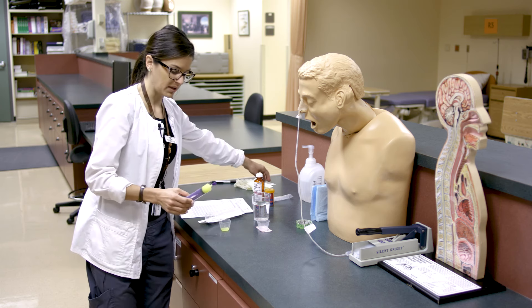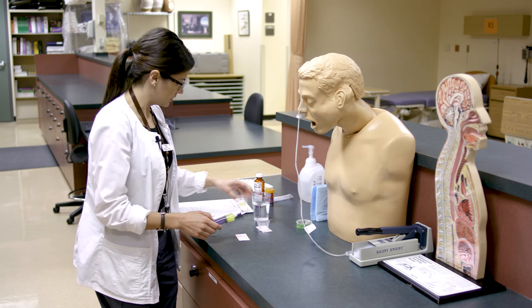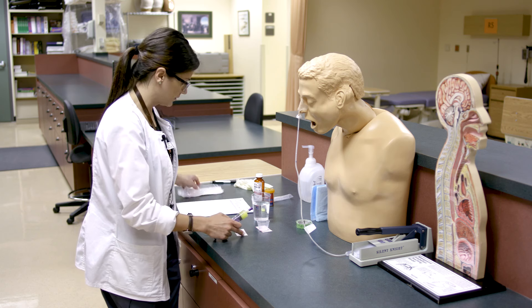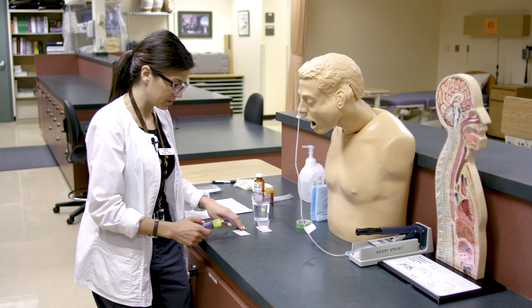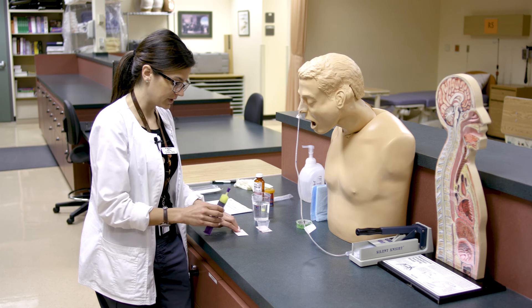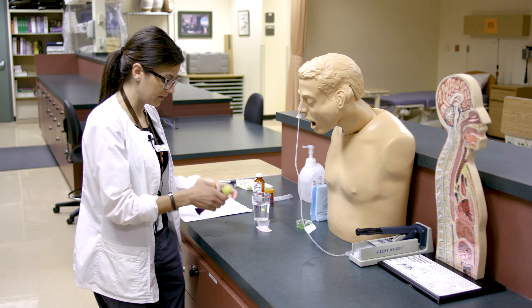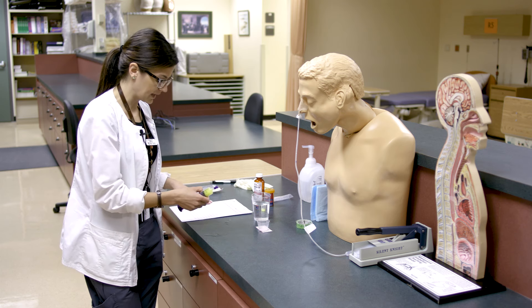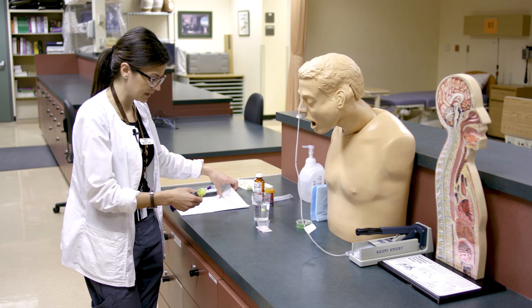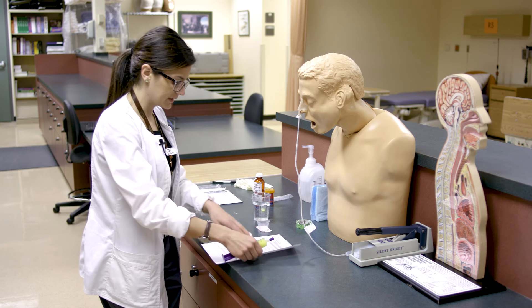We'll make a label for the Dilantin as well — patient name Chris McPherson, drug name Dilantin, dose 250 milligrams, which is equivalent to 10 mLs. Add the date, time, and signature at the bottom. Now we're ready to do our second check.